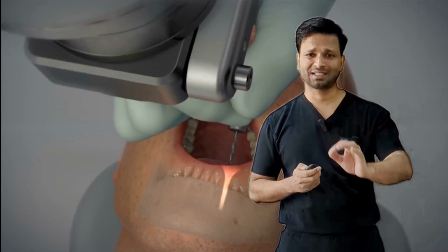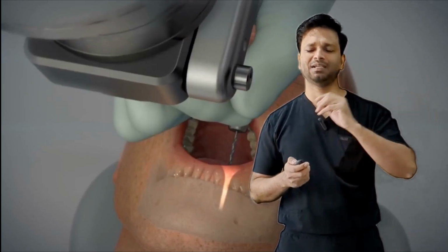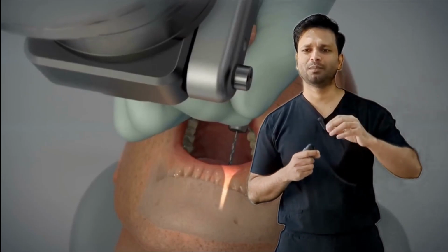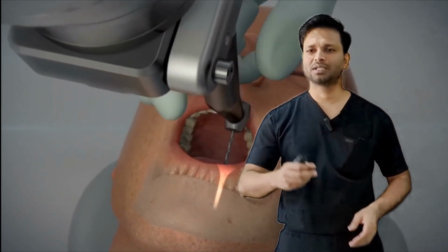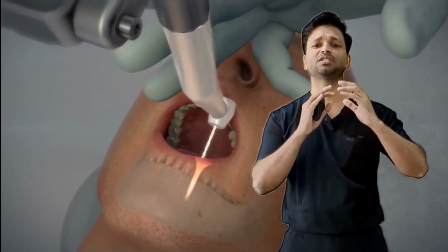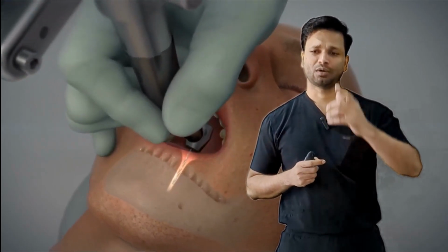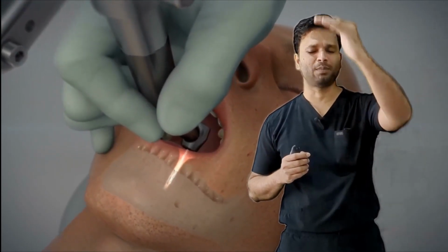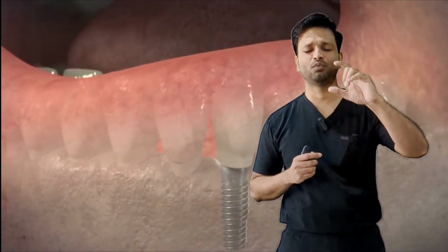Once that is done, you won't be able to move this handpiece laterally. You will only be able to move it in the up and down direction. You can see the operator is trying to give a lateral pressure on the handpiece. Still, the handpiece is not moving because the robot is not allowing the movement. Now, the handpiece can be moved only in the upward or downward direction. And even in that, the movement will be allowed only till the desired depth of the osteotomy.